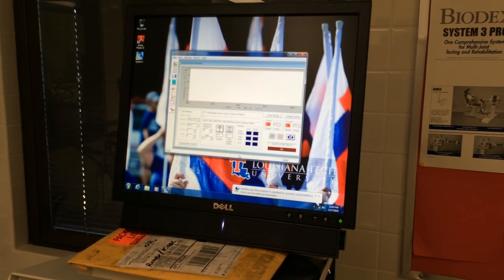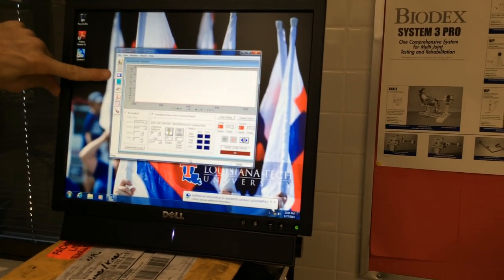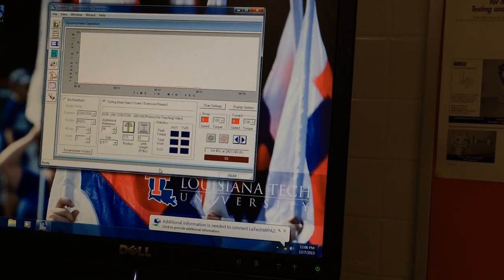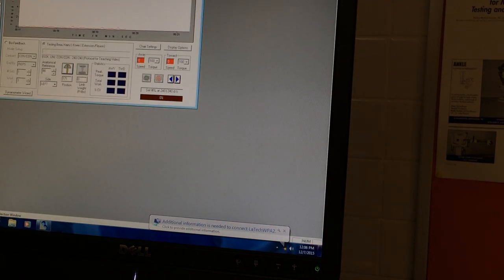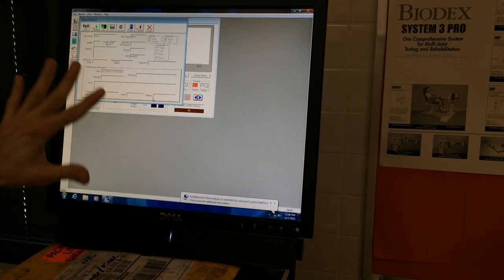Once the software is turned on, we're going to follow it just down the left-hand side. It kind of gives us almost like a checklist. So that's how you can know if you're on the right track, as long as you're following down the line. So we'll increase the size a little bit. We click here, our first tab, which is patient. It's going to bring up the information.